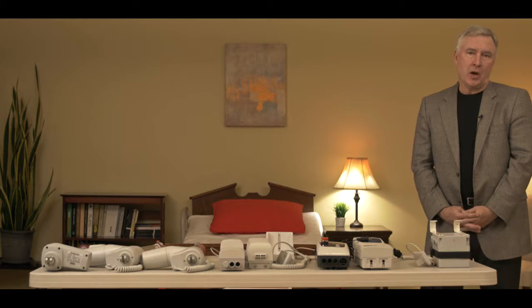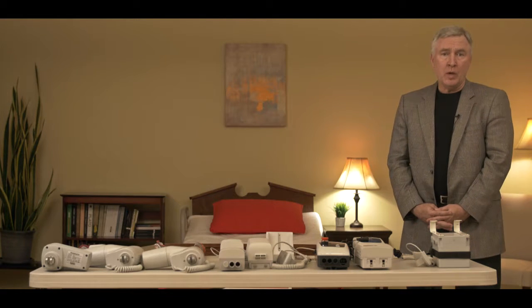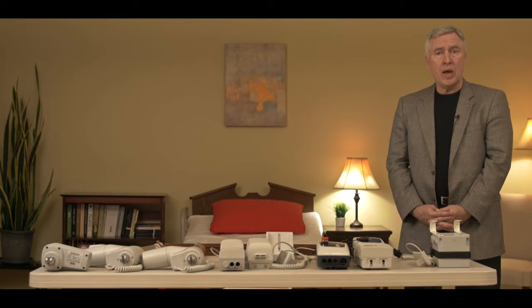Hey folks, this is Damian with BestCare. The purpose of this video is to help you identify what type of BestCare electronics you have on your patient lift, as well as to identify what type of actuator you have on your patient lift.